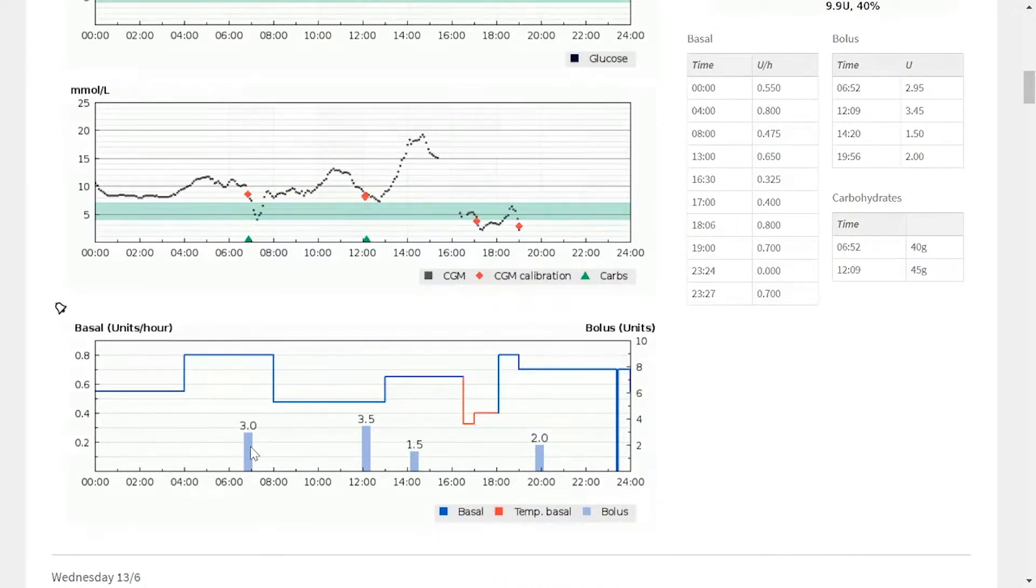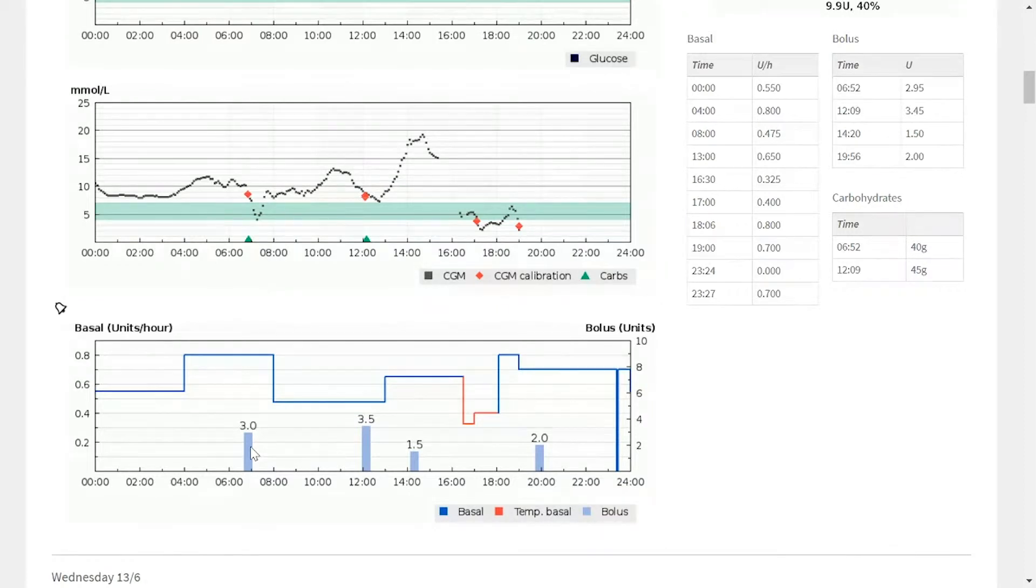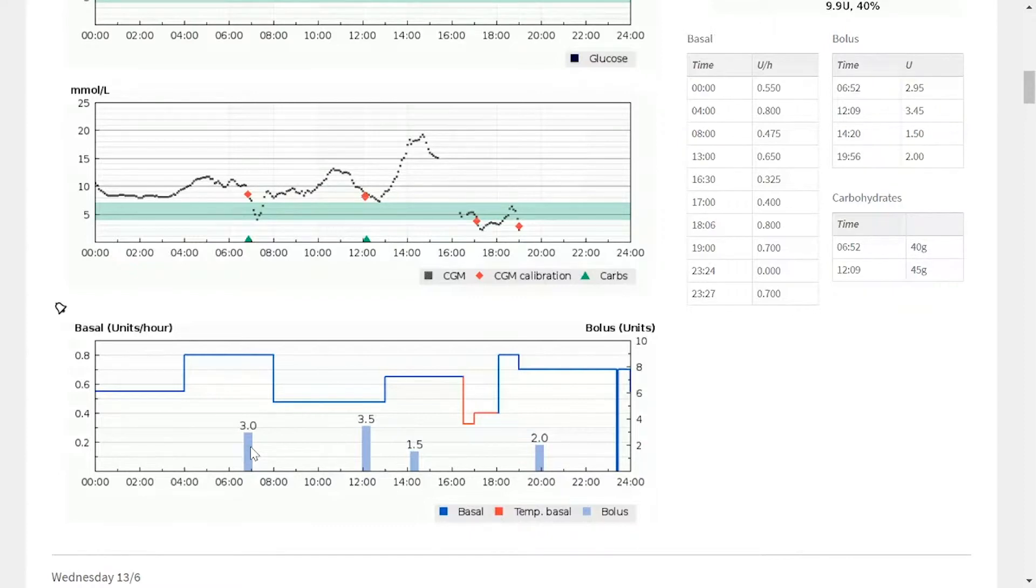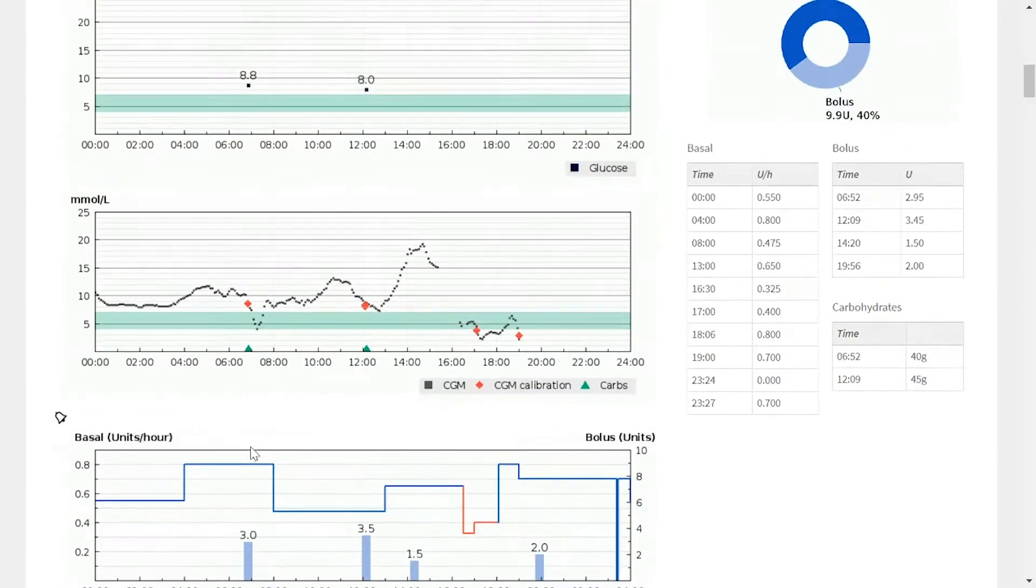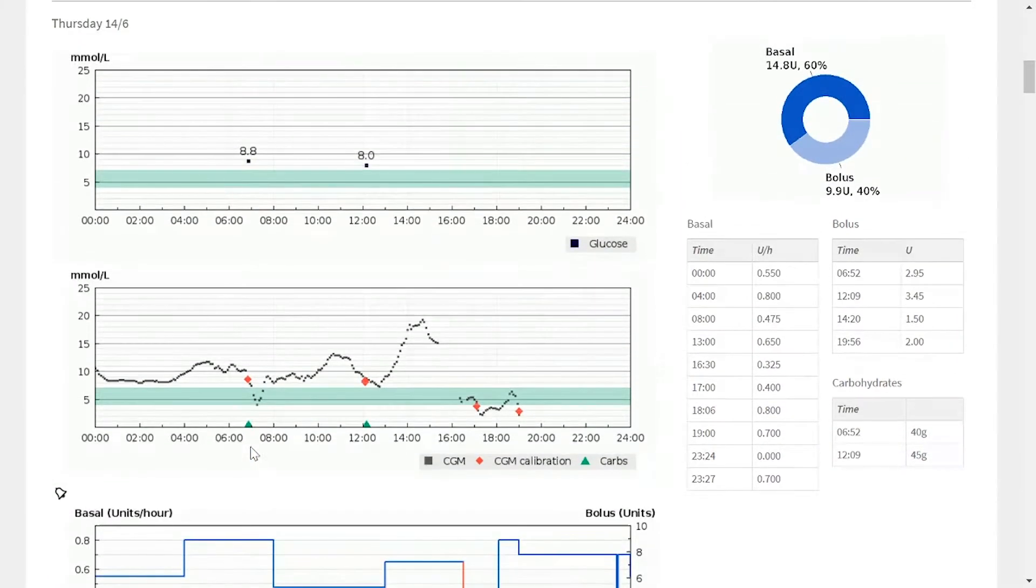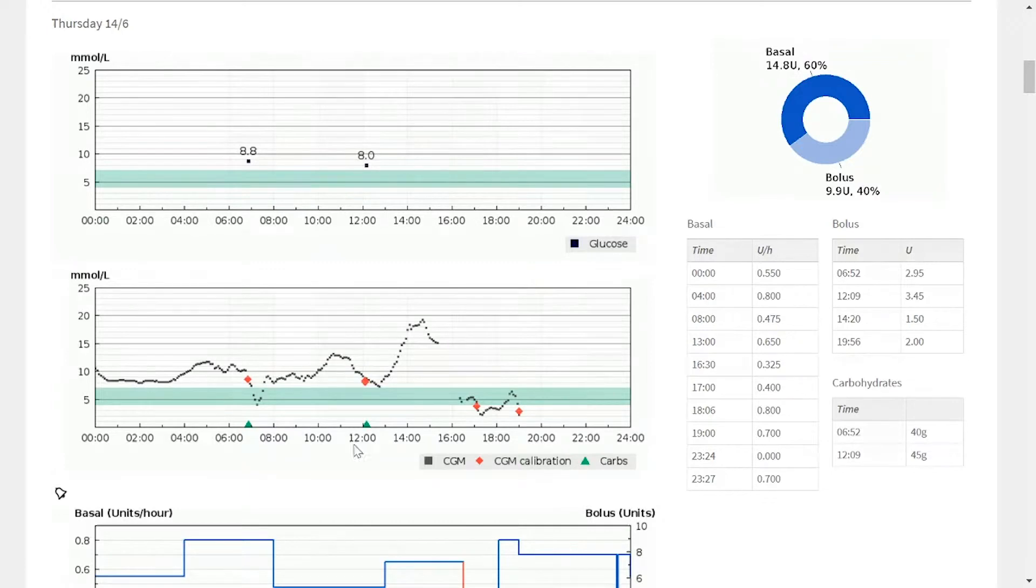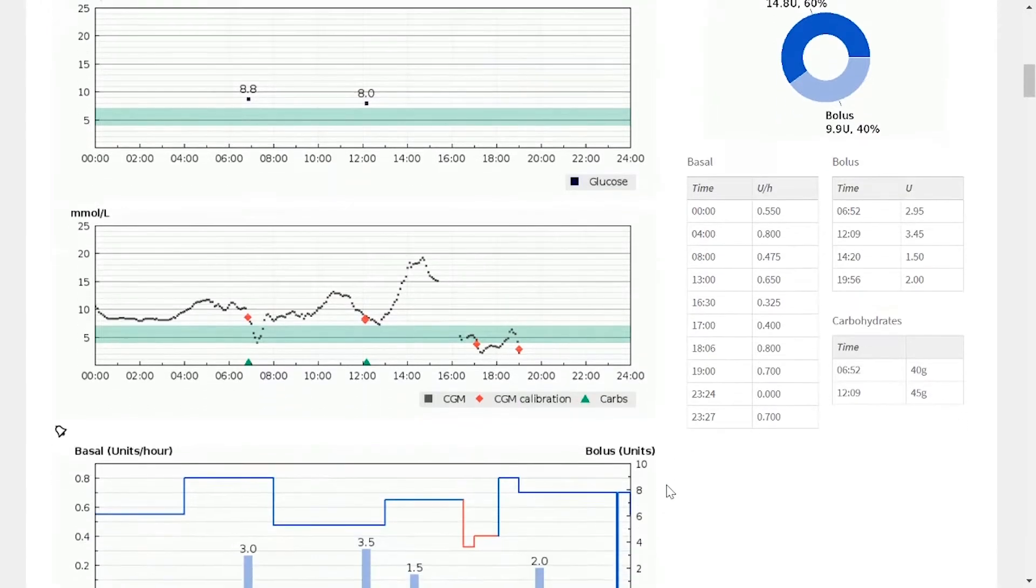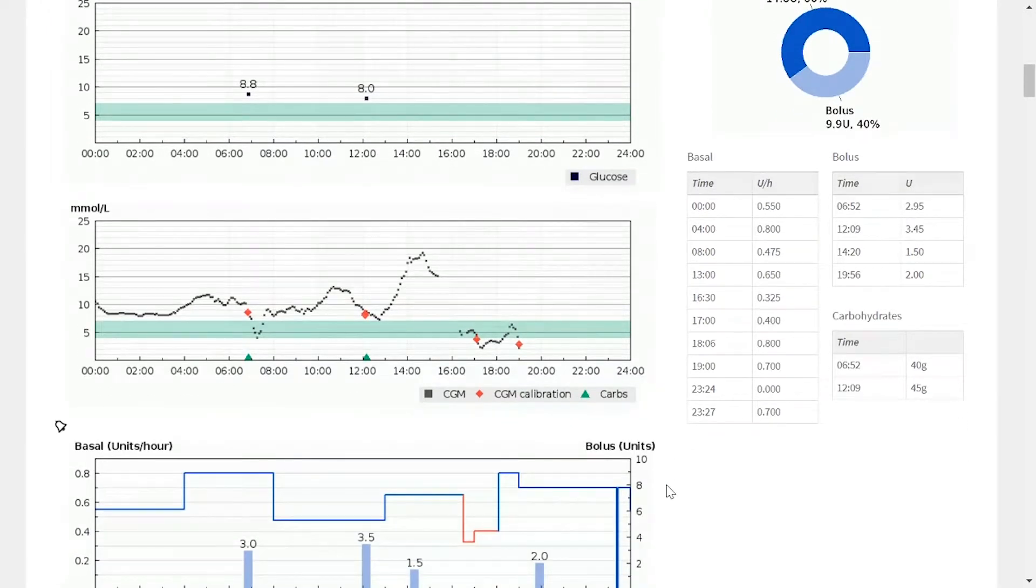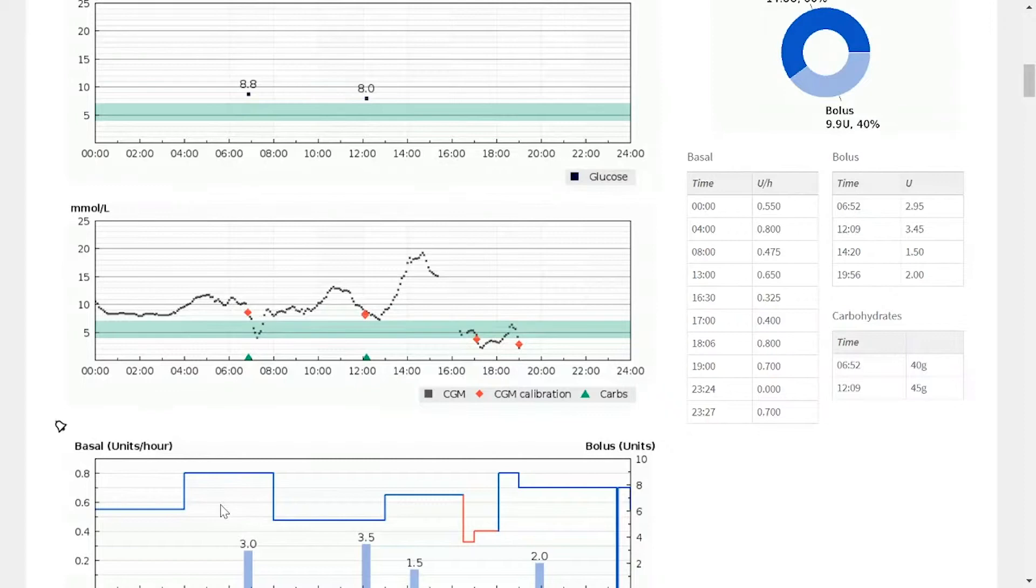Now it's up to the clinician to decide if this is the correct amount, if they'd like to change any insulin sensitivity settings on the pump or even carb ratios, but also have conversations around patient behaviour, activity and any choices that a patient has made to come up with this way of treating this specific situation.